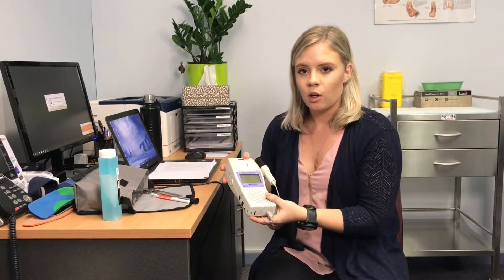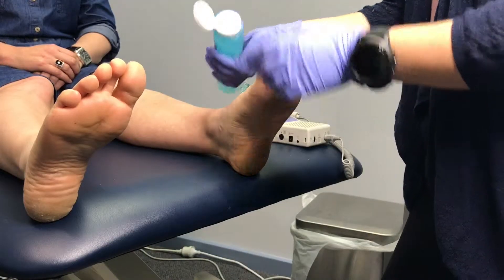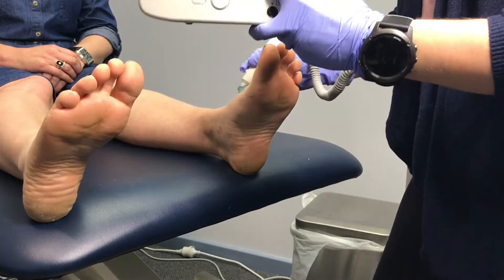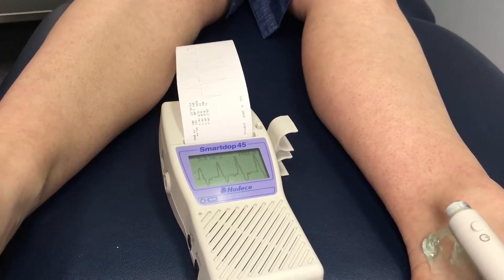The first assessment is the Doppler ultrasound. I use a gel on the foot and listen to the two main arteries in your feet, which gives a good indication of blood flow. Blood flow is really important because it helps to heal any wounds or ulcers — even a little blister on the end of your toe. In a long-term diabetic, that can become an issue as it can get infected, and if there's not enough blood flow to heal it, it can lead to other complications.